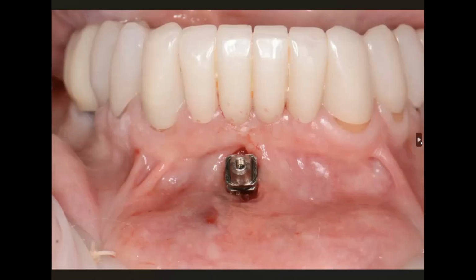And so we take this bone screw and we place it in, and this thing is going to be tight. It is going to be in there at 80 newtons easy. Careful over torquing it, just like you would be careful over torquing any implant. You don't want any iatrogenic fracture of the mandible if you're dealing with a small mandible or anything like that. I mean, very low risk if you know what you're doing, but you have to be cognizant of that. So you're going to put that in there at about 80 newtons.